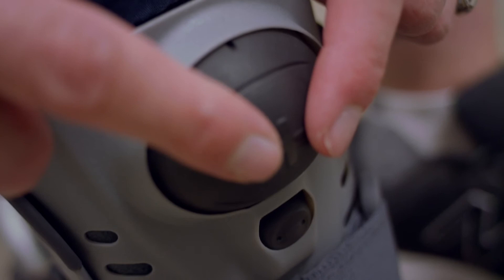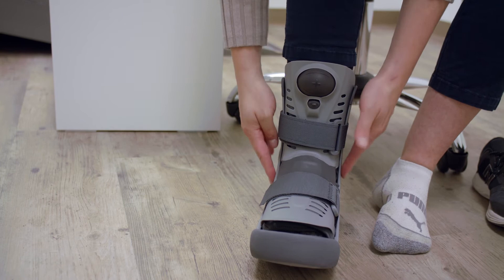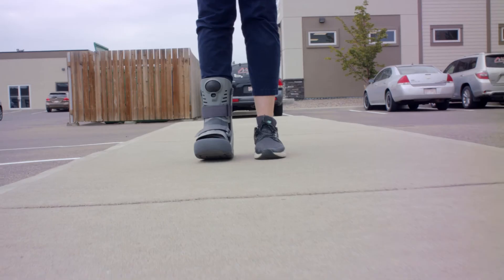If it's causing pain, back it off a bit. Now you can add air — the big button puts the air in, a couple of squeezes, and it goes into the sides to fit it to your ankle. The negative button takes the air out and you can release it.